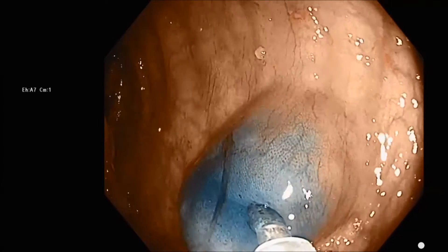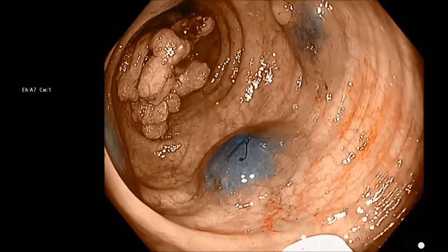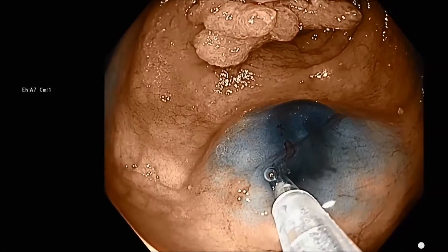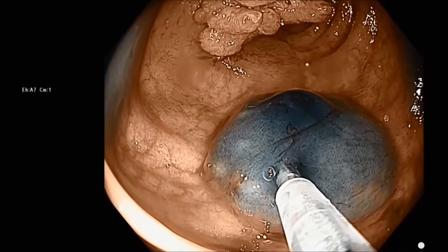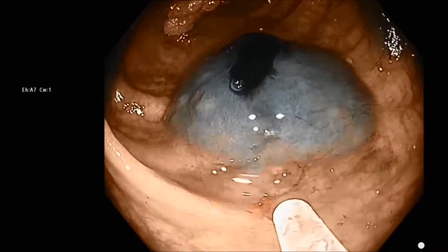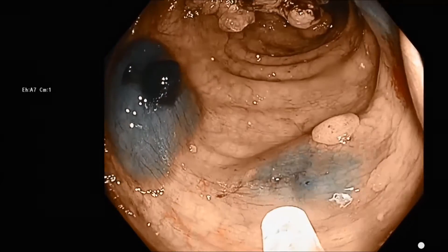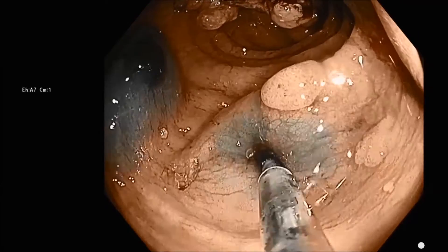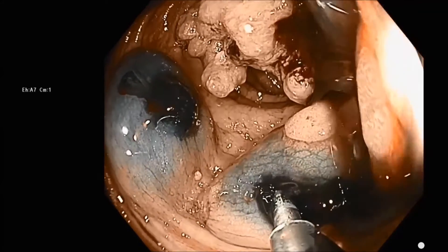Then we're going to inject our tattoo with spot directly into that. Notice how our blebs are spaced around four quadrants and are at the same level, about two centimeters distal to the tumor. We've got the needle in the first bleb and we're injecting a cc of tattoo, then repeating this process, going around and injecting each one with a cc of spot.